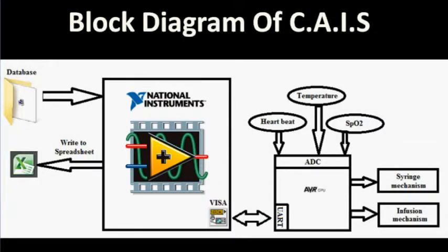Let's take a closer look at our system. CAIS is a semi-autonomous system for calculating and administering the anesthesia dosage. Most of the present-day systems are prone to human negligence, which often has fatal consequences. Our system is a closed-loop system which varies the dosage in real time depending upon the vital parameters of the patient. It consists of sensors which transmit the vital parameters of the system using a UART interface. LabVIEW then uses this data to calculate the dosage and controls the actuators precisely through a microcontroller.